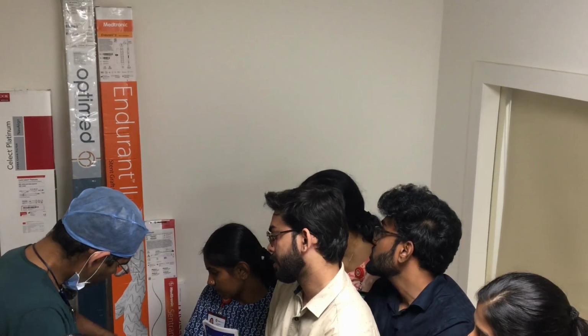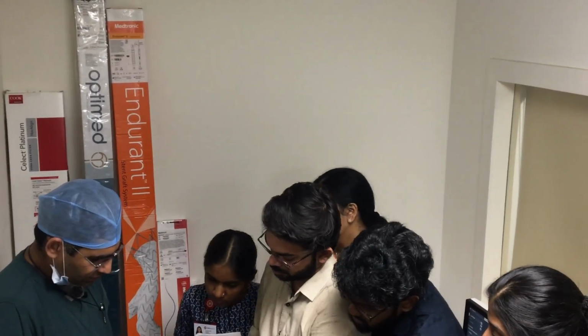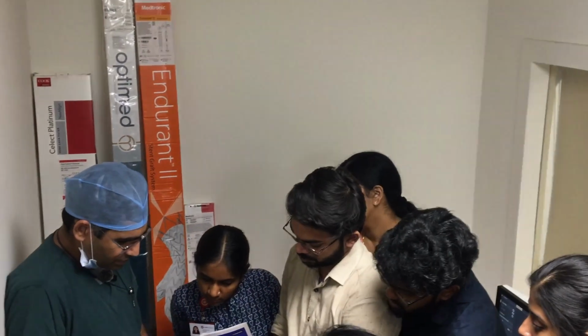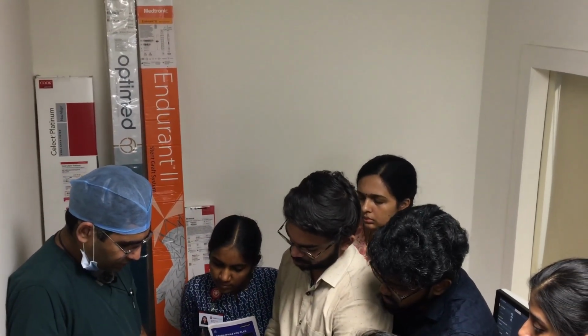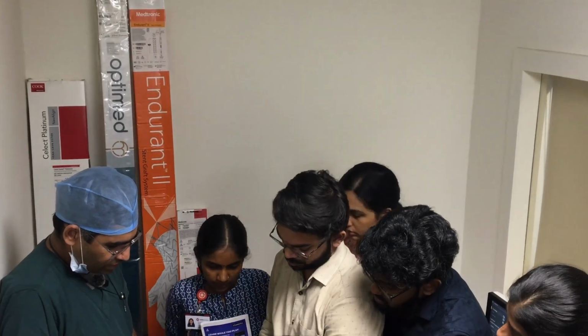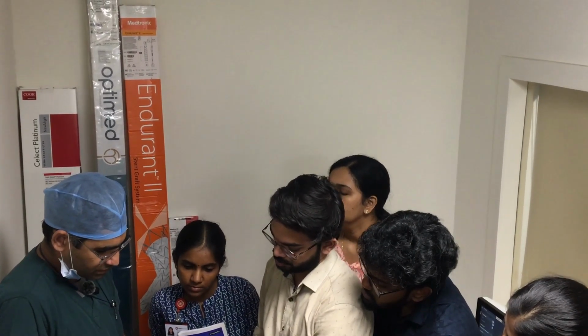So these are, this is a 1-4 wire. You can see the same 1-4 wire. The same company has a 1-8 wire also. Then this is another 1-4 wire. Basically, these are peripheral support wires.